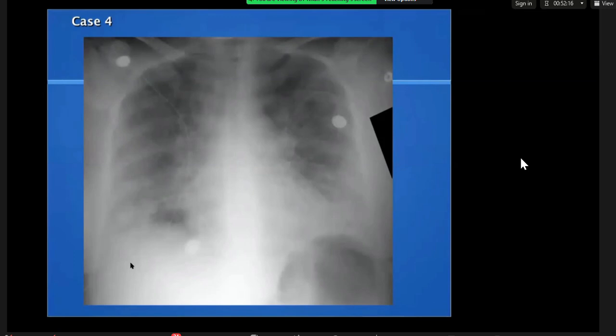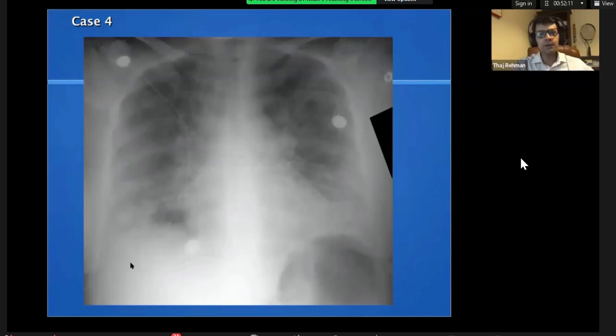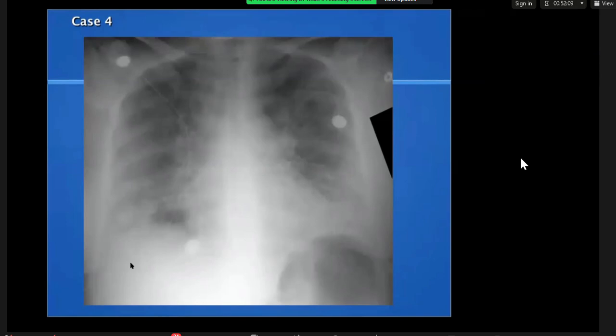So TB wouldn't be. Especially in the current scenario. I don't know whether COP, cryptogenic organizing pneumonia, can involve that as well. And they're also ground glass with a surrounding halo. Good. That would be one. And then aspiration tends to go to lower lobes, but this is more bilateral, so would be less likely.